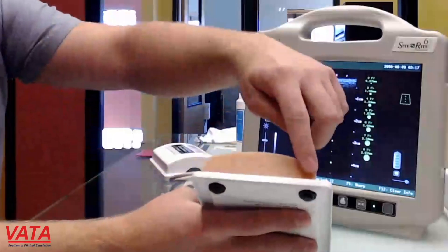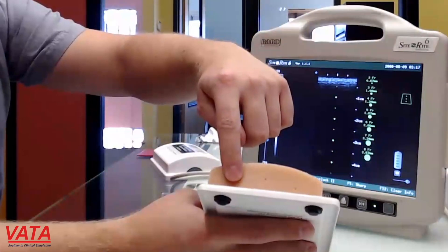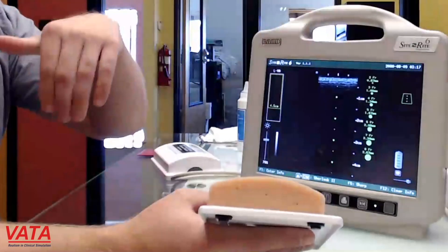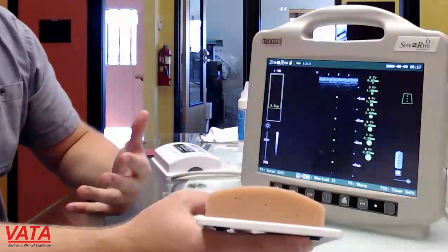What you're going to want to do is use these little dots on the end to help you refill it. We actually have a video that shows you how to do that as well. You can go in there, refill the vein, pull out all the air, and get that image quality to bounce back for you.